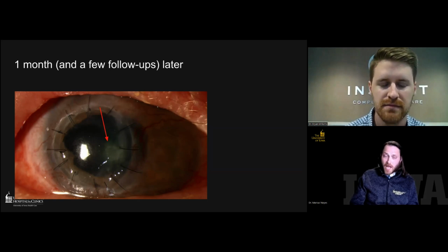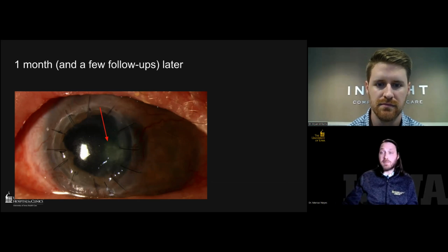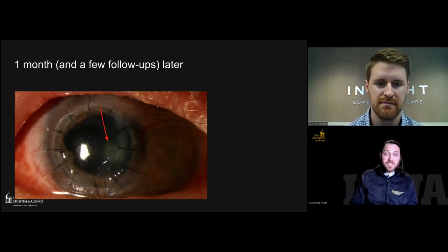Yeah, great point, Bryan. And that was made clear to the patient. To take it even one step further, the corneal surgeon sent him back to me as a Hail Mary, saying, "Hey man, I just used whatever graft I could. I consider this a non-optical graft." He didn't expect the patient to get vision back out of it. So this was purely to save the eye at this point.